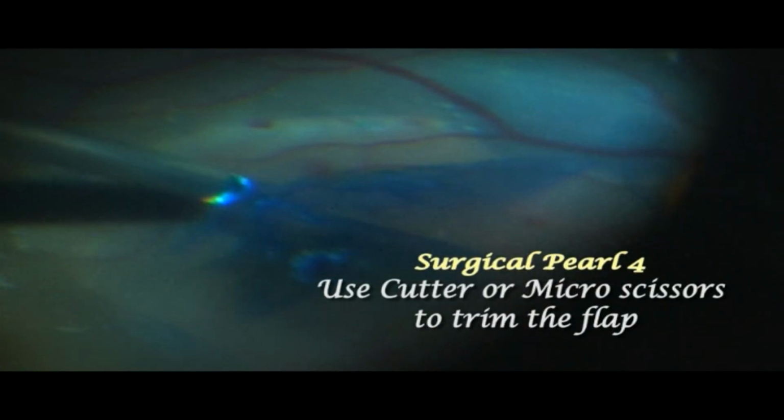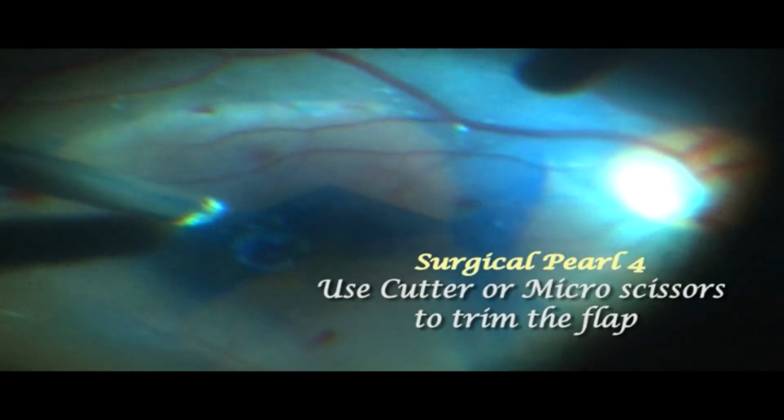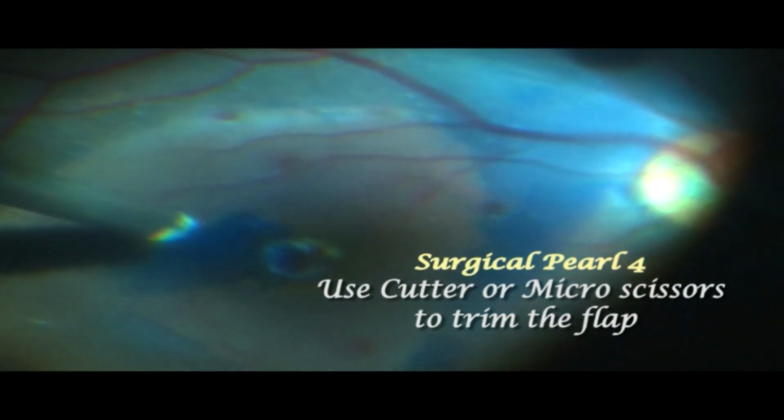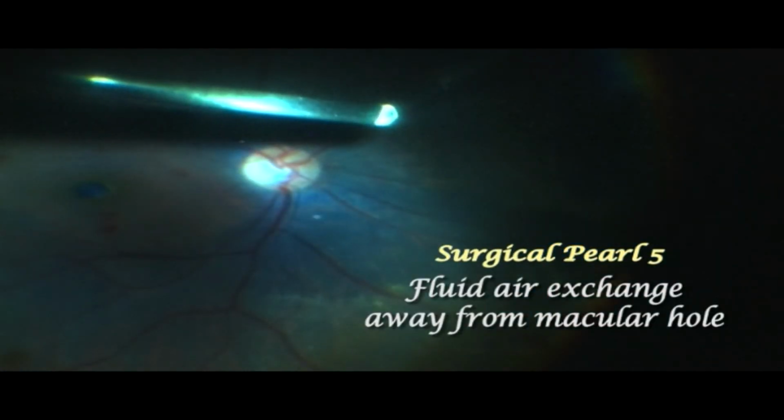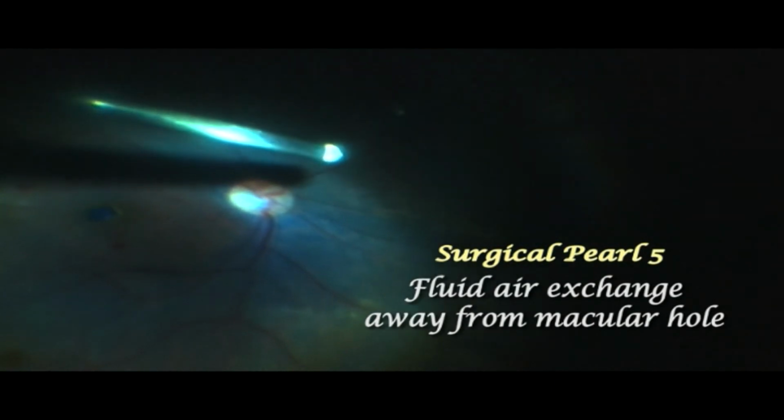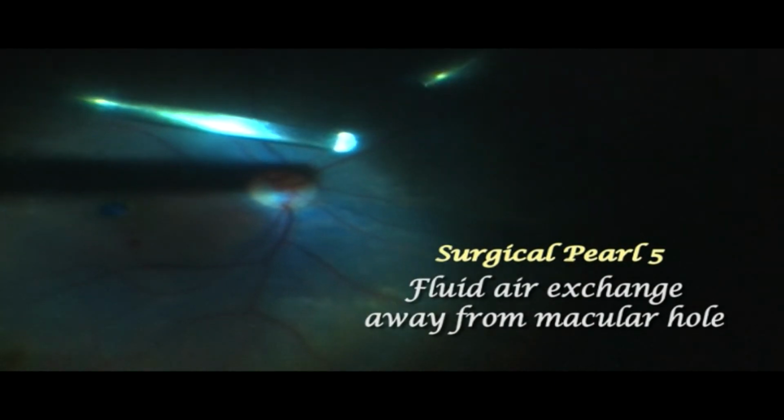The ILM was then trimmed with the vitrectomy cutter and ILM flap was gently inverted over the macular hole. This was followed by fluid air exchange and gas insufflation.